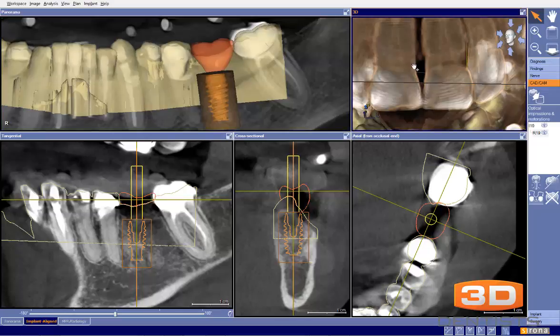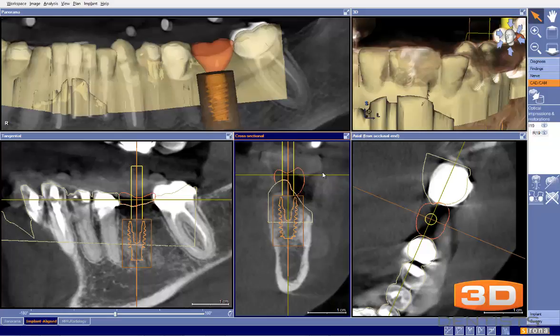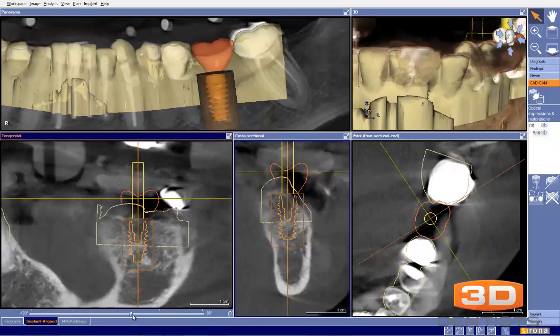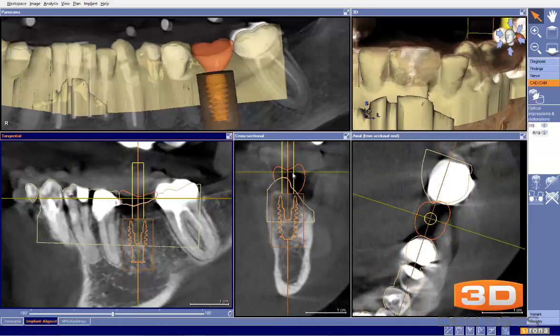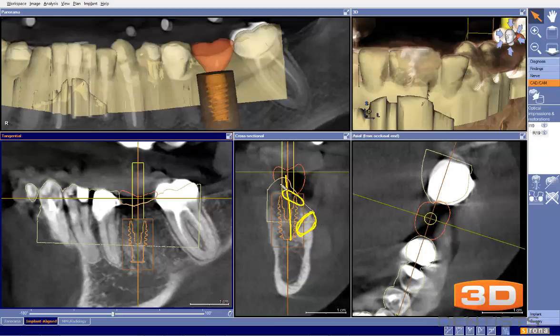From an implant planning perspective, this should work quite nicely. Surgically, everybody's going to be at a different level of comfort. But I would expect to raise a flap all the way down, do a little bone contouring to gain access to this root, tease that root out, then do your osteotomy, place your implant, graft around the exposed threads, and in this defect site place a membrane over the top along with some PRP and PRF, then suture over the gums completely to get primary closure. Surgically a very doable case, prosthetically a very doable case. Thank you for submitting the case and I hope you found the information very helpful.